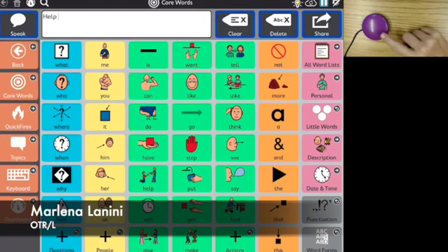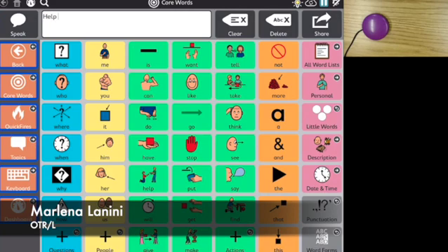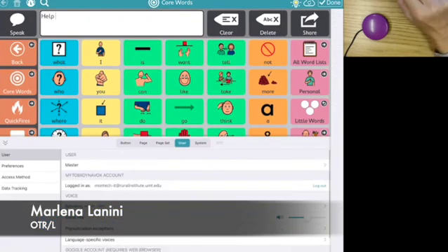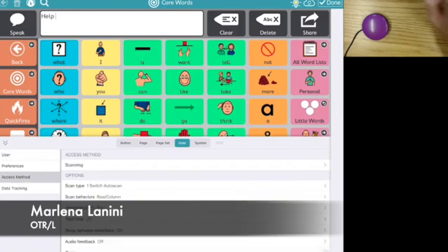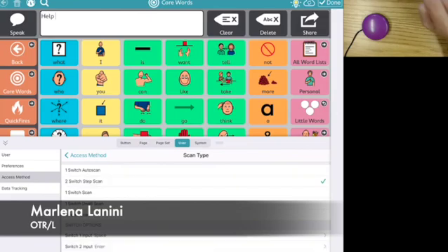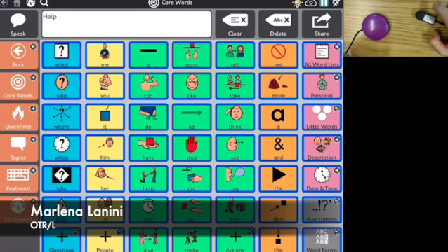Let's see what we can do if we add a second switch. I'm going to go back into my settings and go to my access method again. Instead of one switch auto scan, I'm going to use two switch step scan. So what two switch step scan does is now I can use two switches and I have a lot more control over what happens on my communication device if I can use two switches.